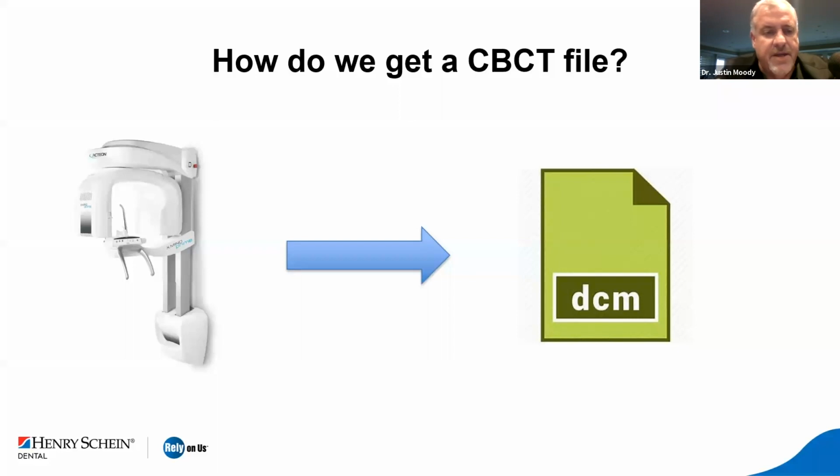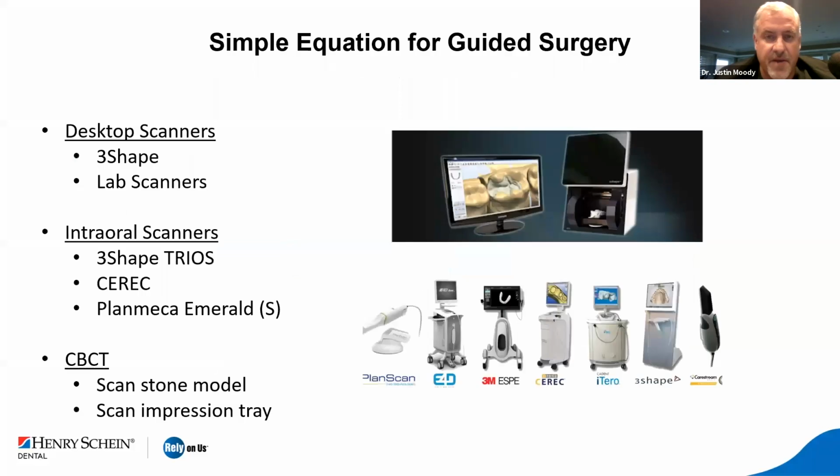And today, we get a machine that's got better software, almost just as large a field of view, and it's under $50,000 with a warranty. So just one of those few things in life that the prices actually come down instead of up.